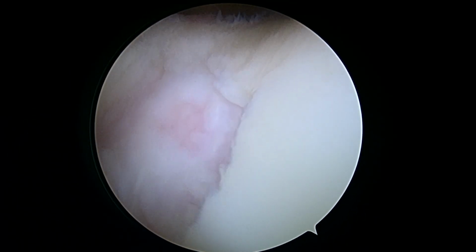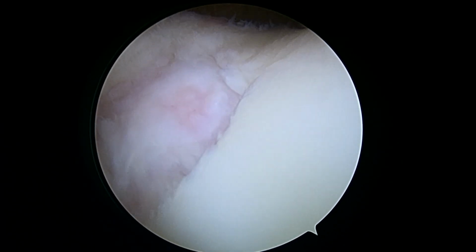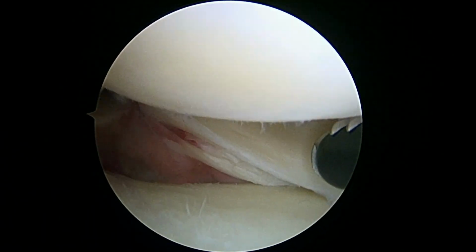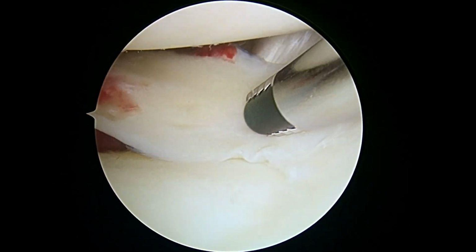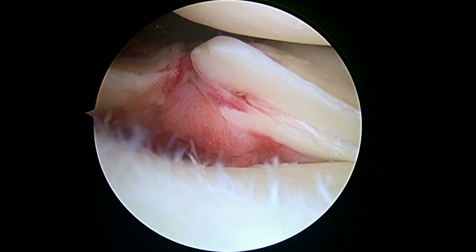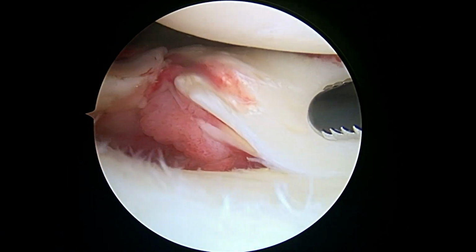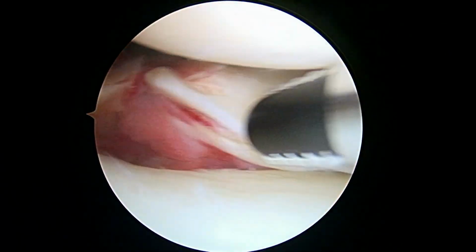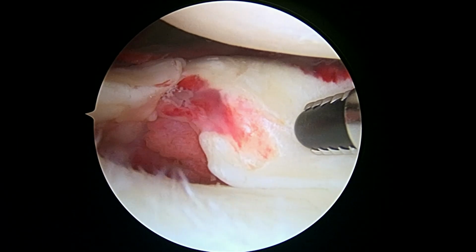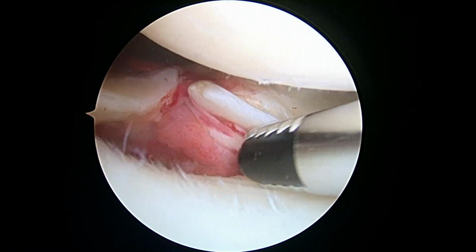Okay, so I wanted to show you next, let's go ahead and bend the knee again. I wanted to show you the lateral compartment because you do have a meniscus tear that we're going to try and address. Okay, so here's what we're looking at in the lateral compartment. This is the lateral meniscus. We're just posterior to the popliteus here. And you can see we've got these splits in the meniscus, both a horizontal one that way and a vertical one right there. So we're trying to figure out how to save this. And it may take a couple implants. But we'll get to work on constructing something here.